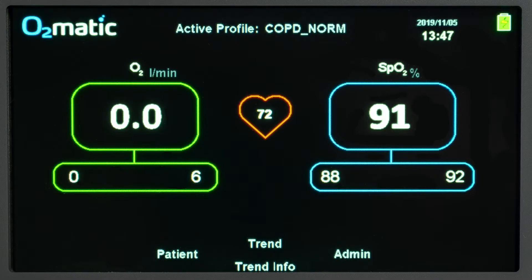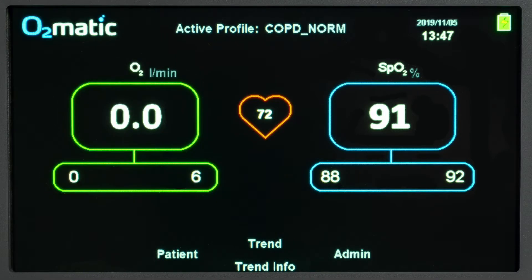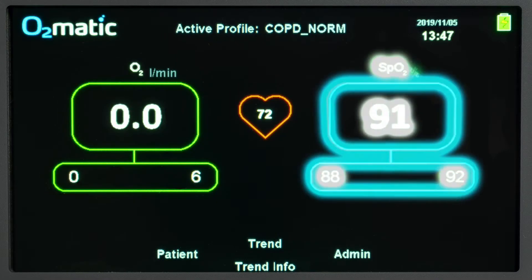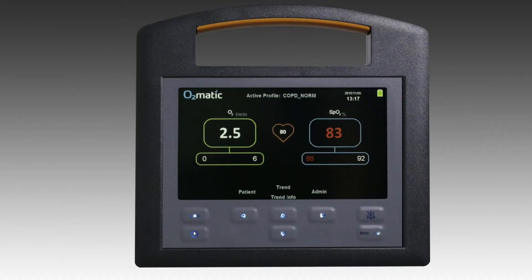Oxygen flow delivered is shown on the screen alongside the heart rate and SpO2. During use, the O2Matic will adjust the oxygen flow to the patient to maintain their oxygen saturation within the set target range.